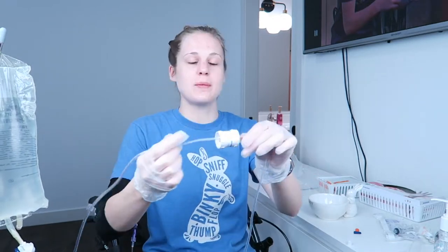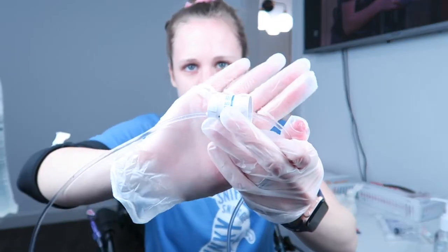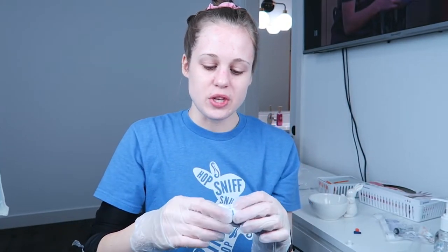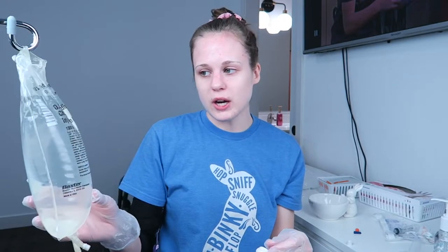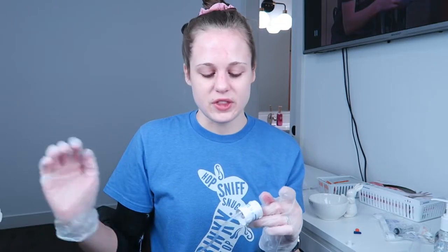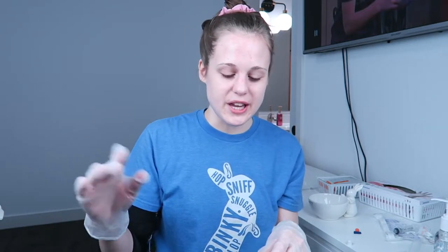Anyways, because I don't have a pump, I have this little dial thing, which I don't know if it's going to focus on. But basically this dial is controlling the flow rate. You can only make it as high as 250 milliliters an hour, which, if it did run exactly 250 milliliters an hour, would mean it would take about 4 hours for this bag to completely go into the body. However, this isn't science, it's not exact. It also depends how high your IV pole is, and other variations as well.